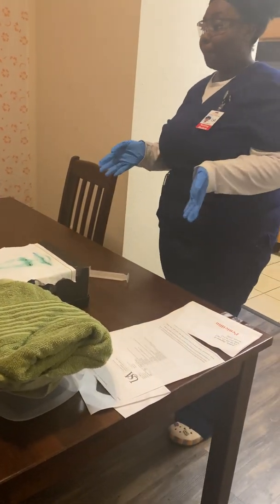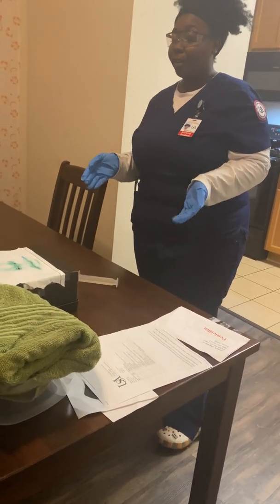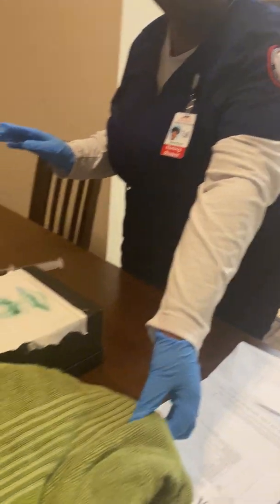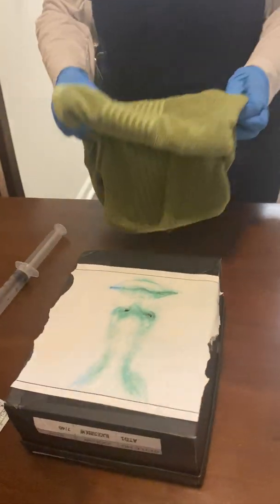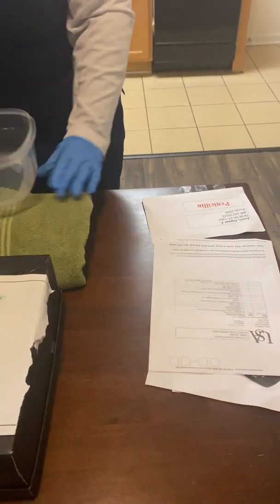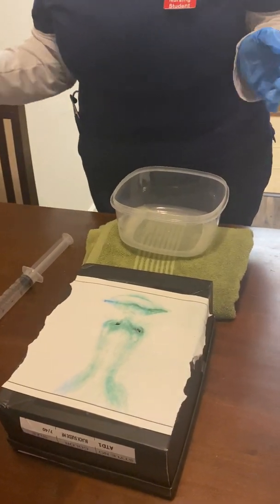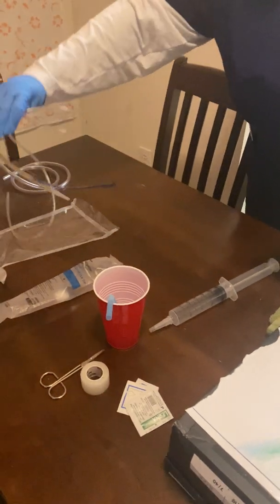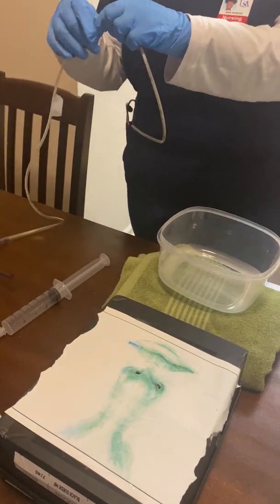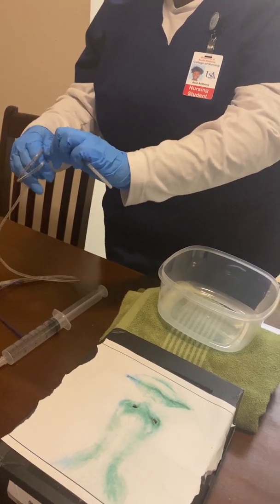And then the next part of my procedure would be to measure my NG tube, but that has already been done. So next I am going to place a towel on their chest and place a bowl on their abdomen to catch any emesis just in case. And then next I'm going to take this and coil it around my fingers. I would also state that I would have prepared my tape back at the other step, but I already had it prepared for my video.